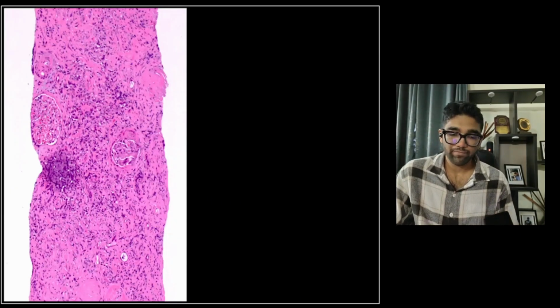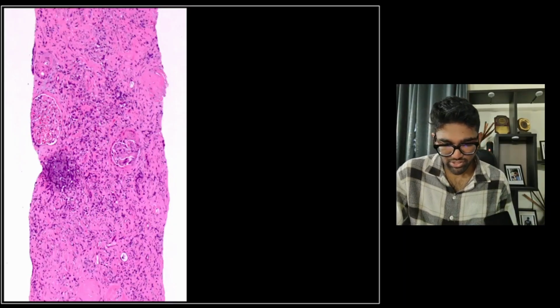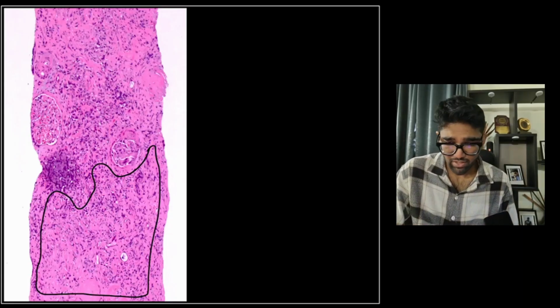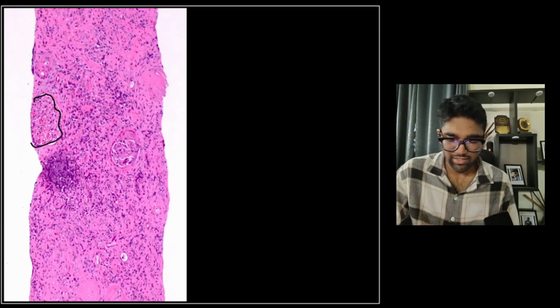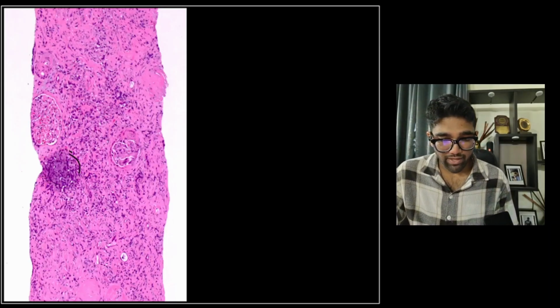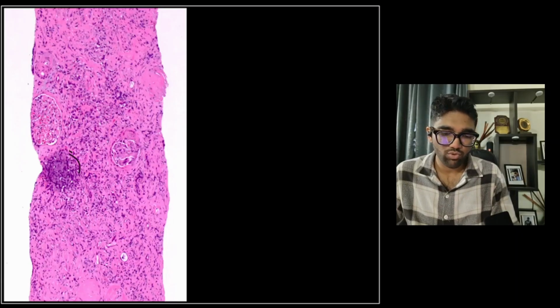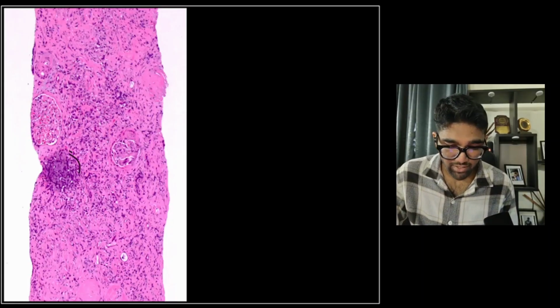So what do we have here? Here, what we find is there's a lot of interstitial deposition of collagen. That is the eosinophilic material that is there in the interstitium. The glomeruli are actually not normal per se. There's a little bit of lobularity to the glomeruli, and there is an obsolescent glomerulus here. And so I would actually not just call this interstitial nephritis. This is more suggestive of a proliferative glomerulonephritis with some interstitial nephritis.